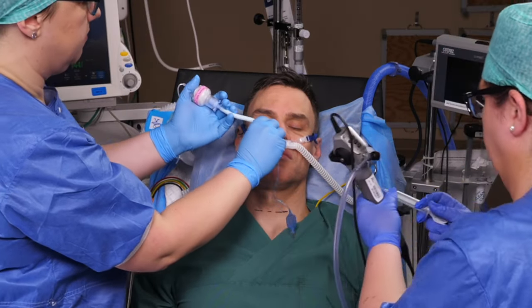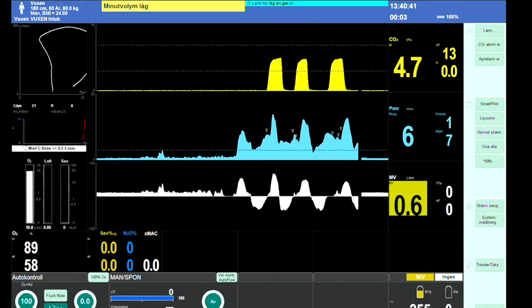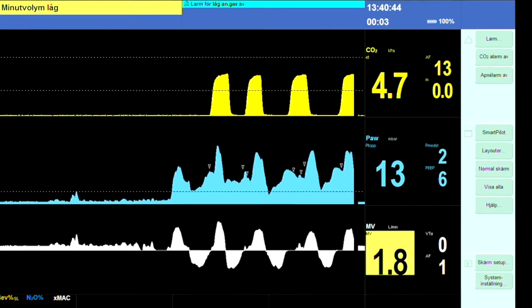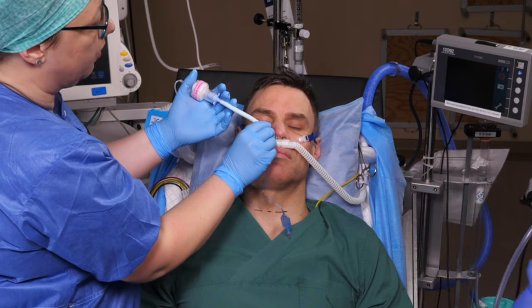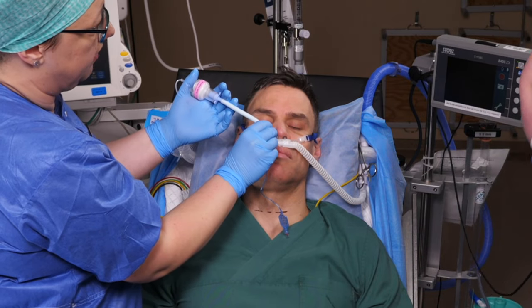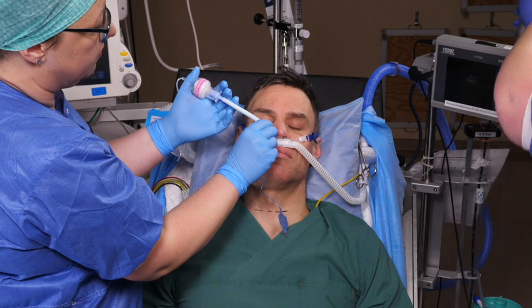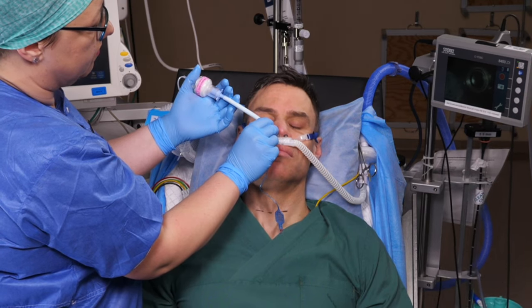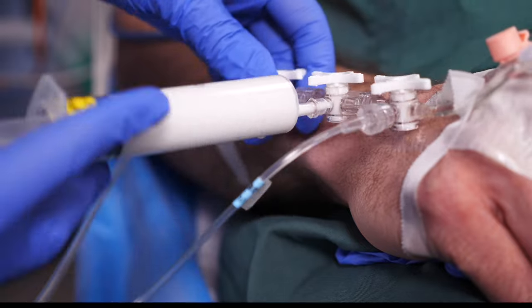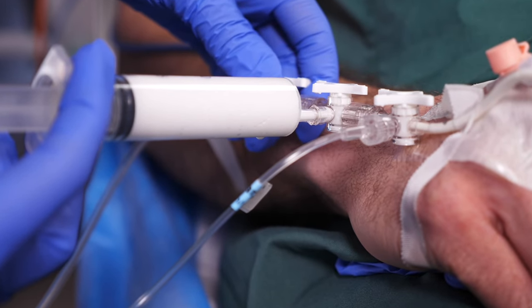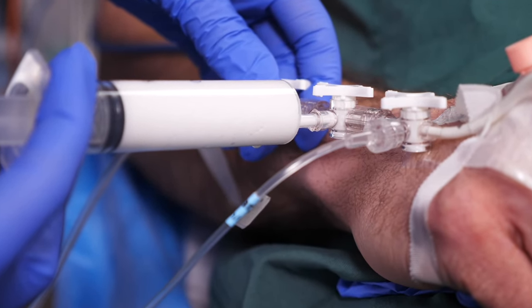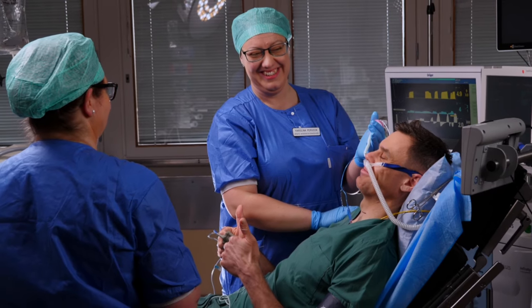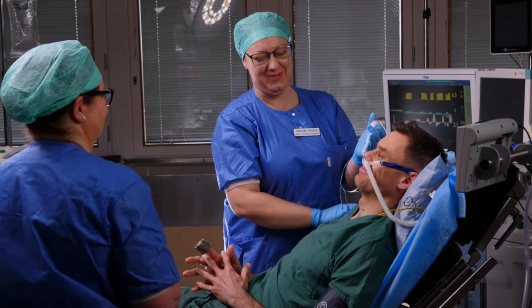Connect to the ventilator and confirm end-tidal CO2 waves on the monitor. Visual confirmation of the tube in the trachea combined with end-tidal CO2 is a two-point check for correct placement. Now inflate the cuff and sedate the patient further if required. Congratulations — you have now performed an awake fibre-optic intubation.